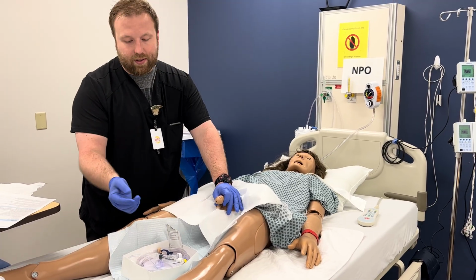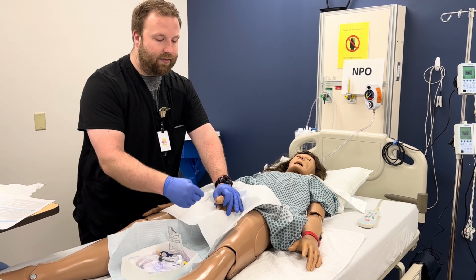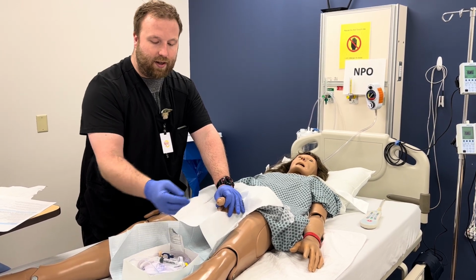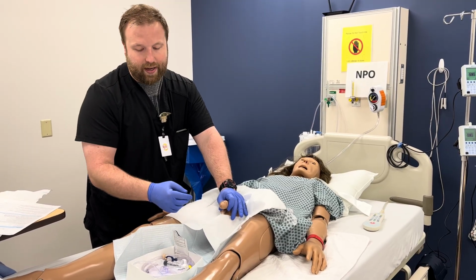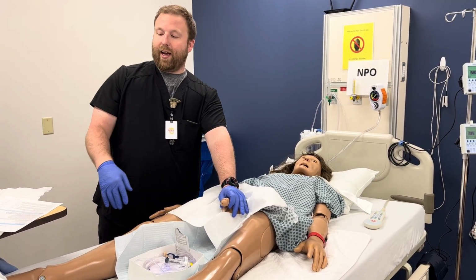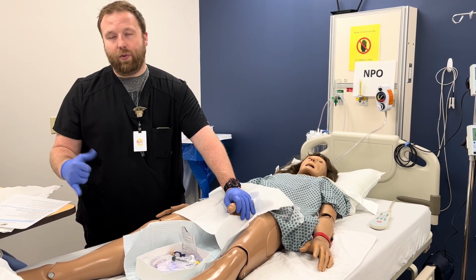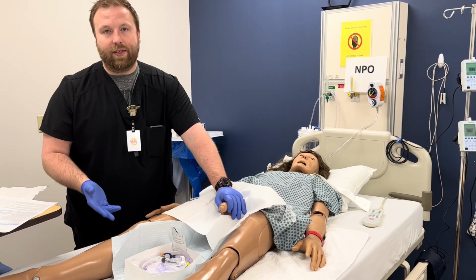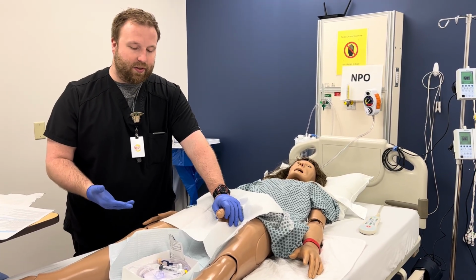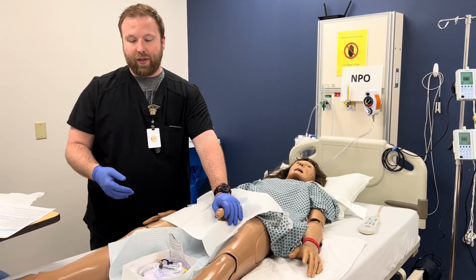I'm just going to throw this to the floor or wherever to get it out of the way. I'm going to clean for a second one, clean, clean, clean. I'm tossing, and I'm going to clean again, and I'm throwing that out. Now, I've cleaned 3 times, and I want you to discuss why are we cleaning with swabs after we have just performed pericare. Soap and water is not going to kill all the germs. We're trying to get this as close to a germ-free zone as possible. That's why we use the extra cleaning.